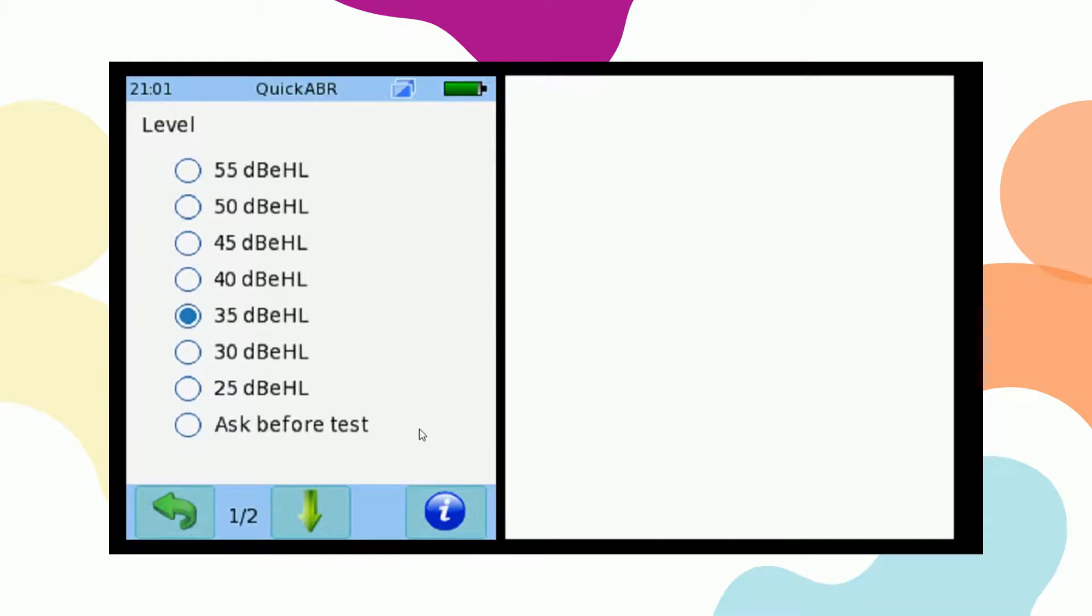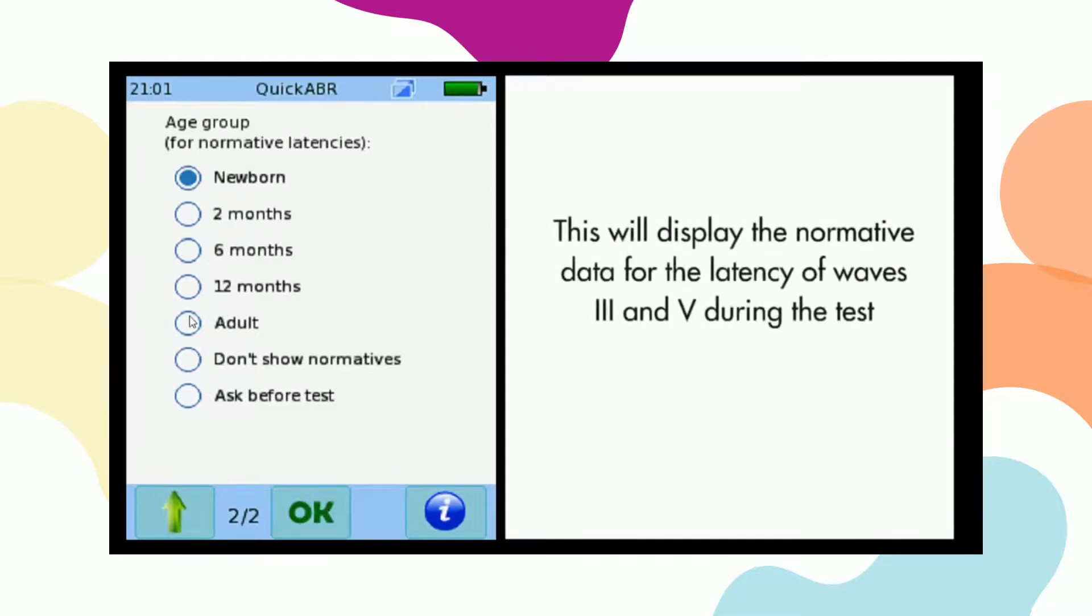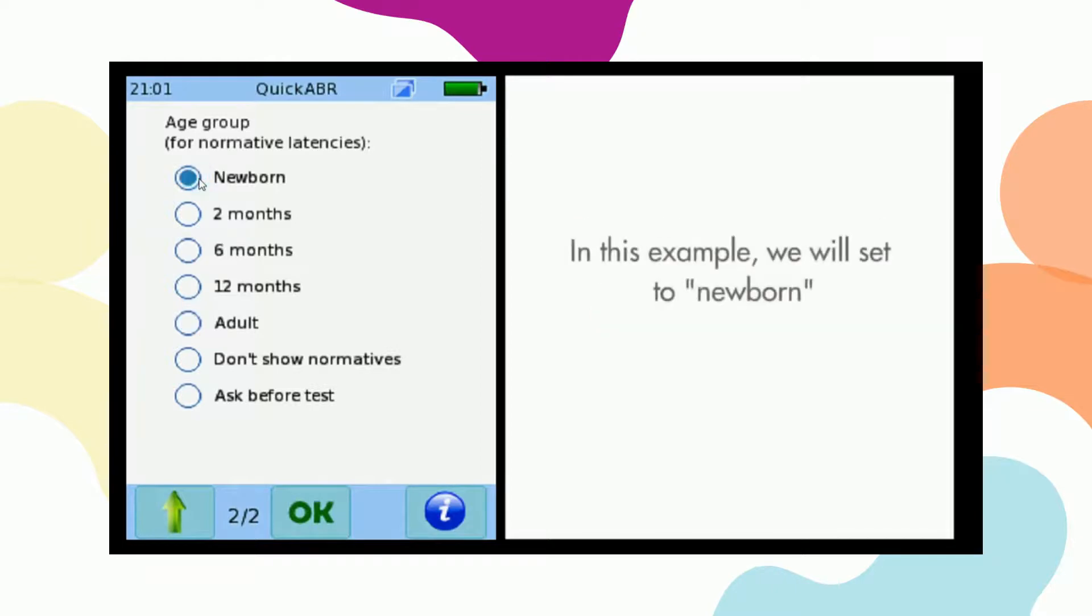Next, click on the arrow key to set up the normative data. Here you can set the normative data display for the latency of waves 3 and 5. We'll set this to newborn for this example.